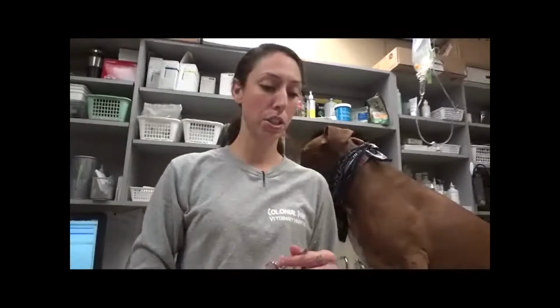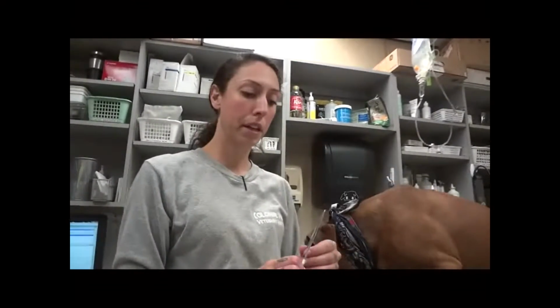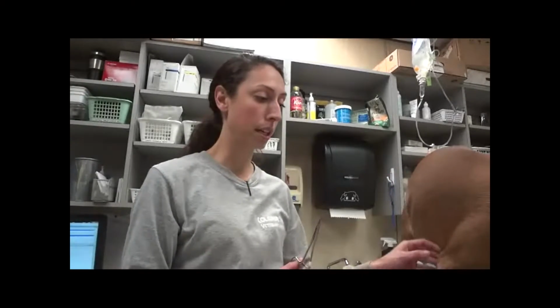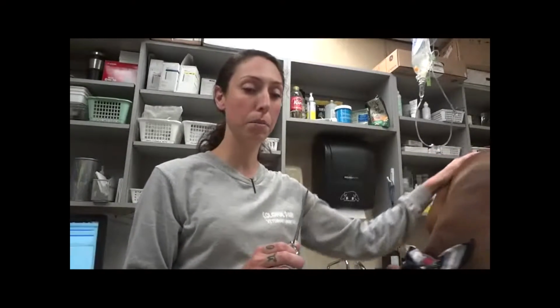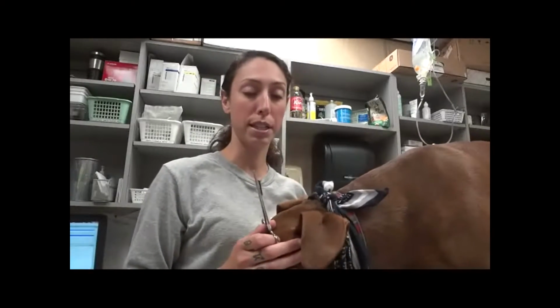Alright, today we're going to be showing how to collect a sample for fungal testing. We're going to be using the hemostat technique, which is where we'll pluck 10 to 20 hairs from the site of a lesion. The other technique is a toothbrush technique, where we'll use a clean toothbrush and brush against the hair follicle about 20 to 30 times. That is typically used for cases where there are no lesions present.